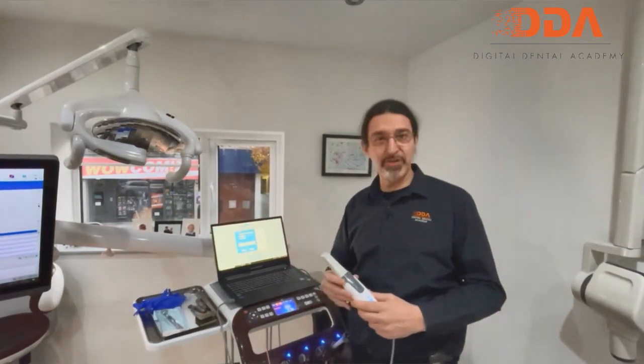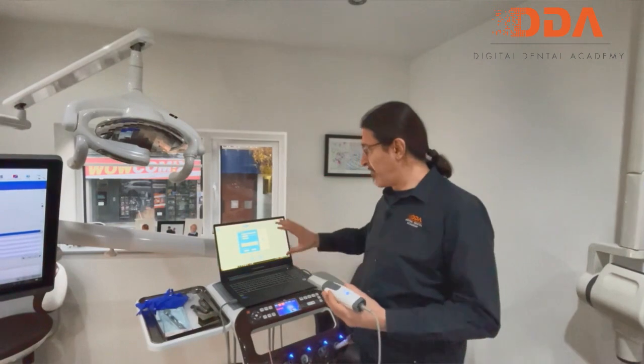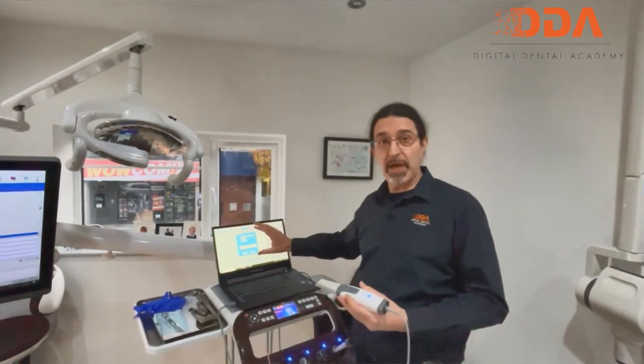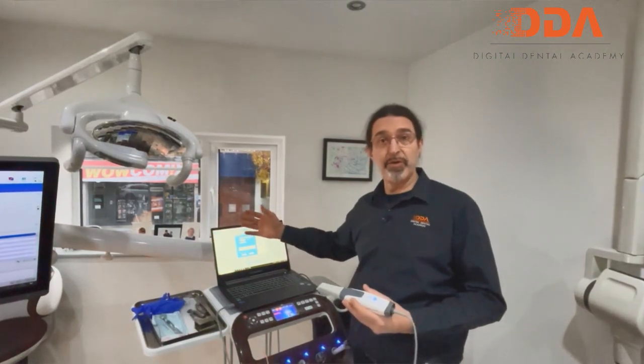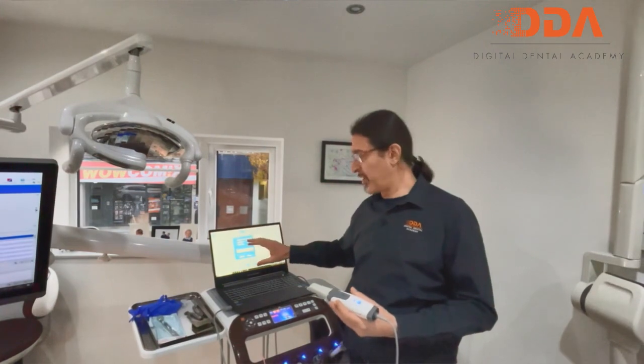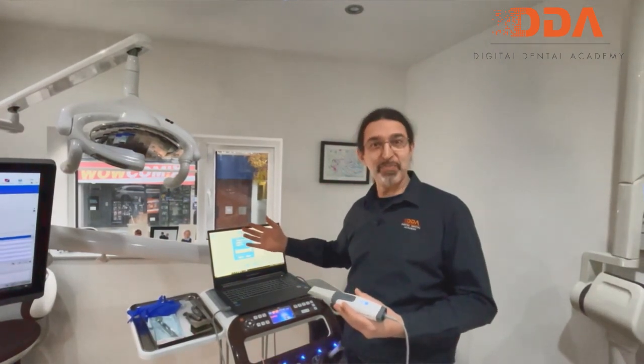It's going to replace all the impression material in your practice. It has a very simple software — approximately 80 megabytes. All it does is capture data. You then export the STL directly to your laboratory or into your design software. It's a capture software, not a design software. Let's see how this performs.